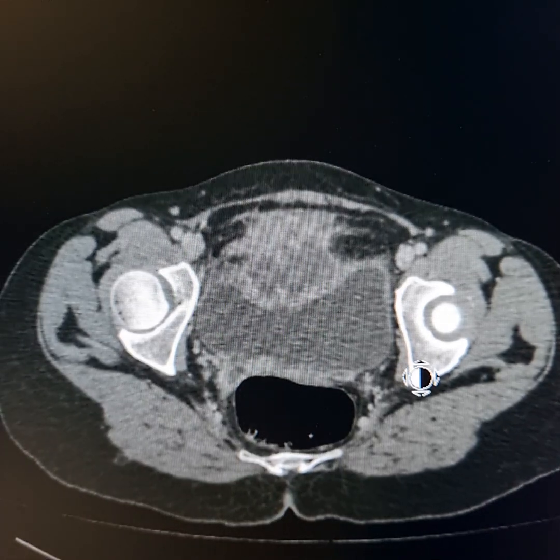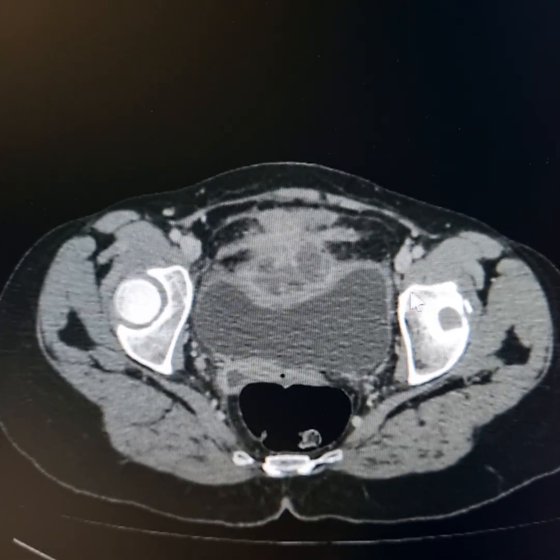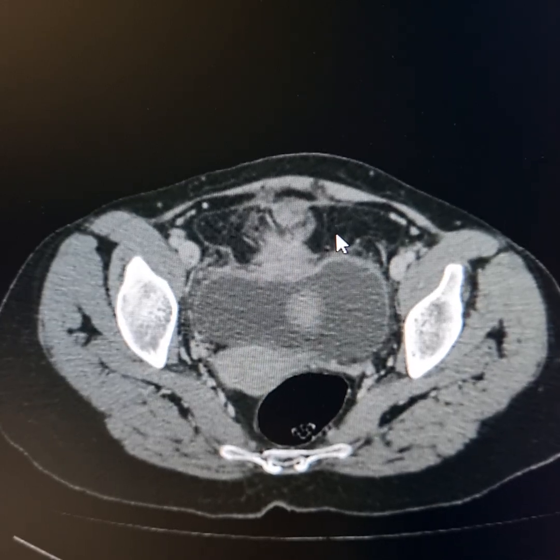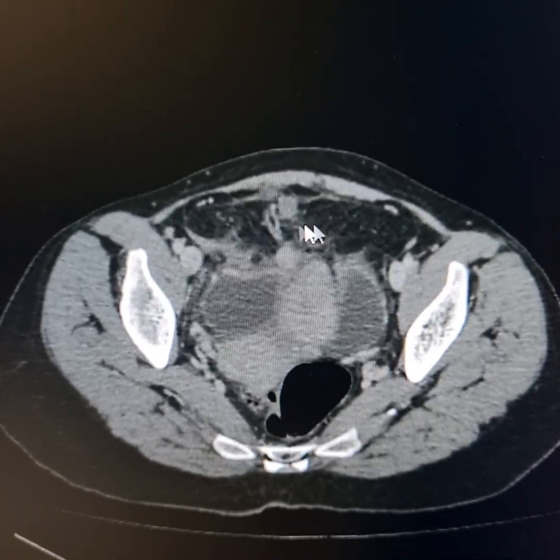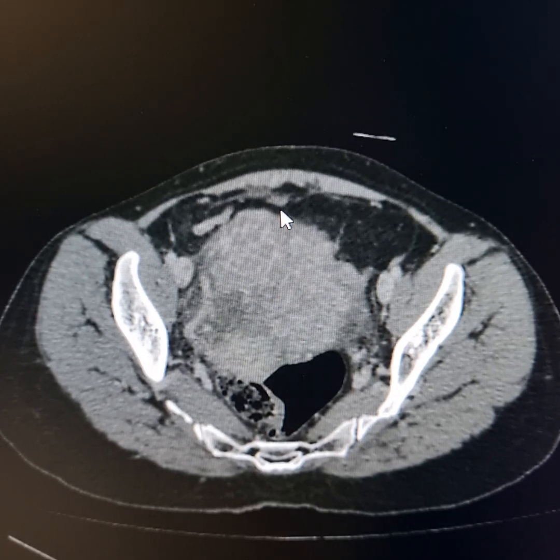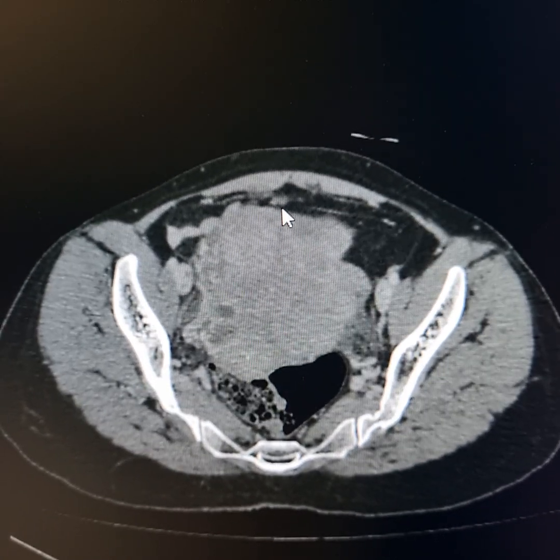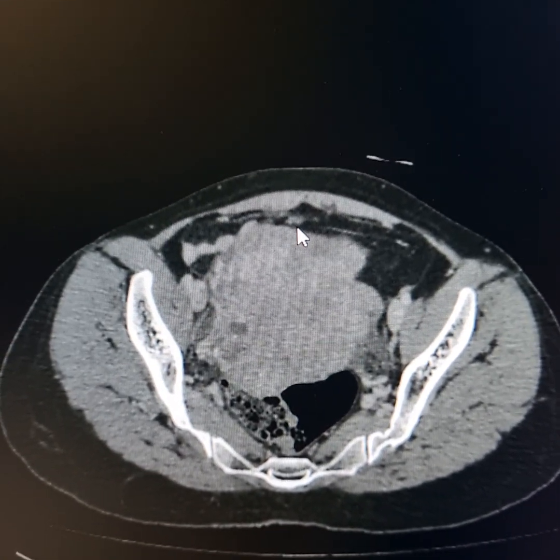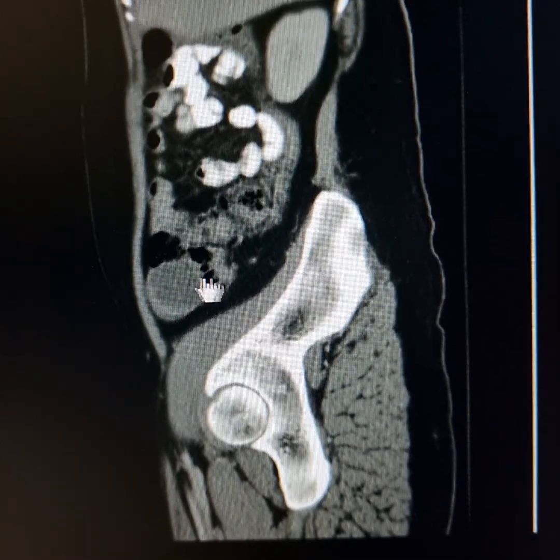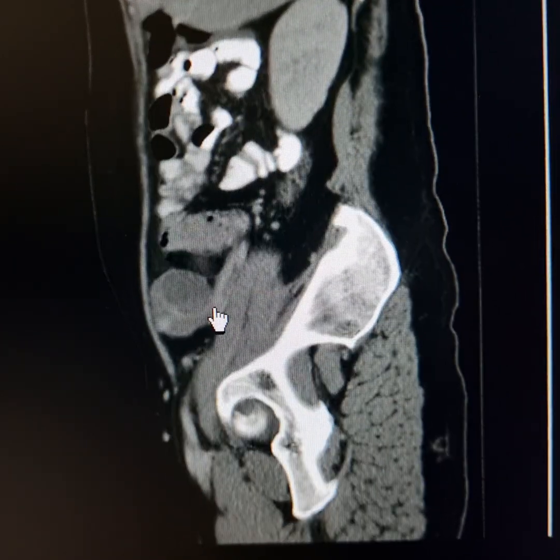Please observe the surrounding inflammation and increased density of the adjacent fat, thickened peritoneum. Now this is the median umbilical ligament, which is inflamed and thickened, this one. This is the sagittal scan. Now this is the follicular cyst in the right ovary.